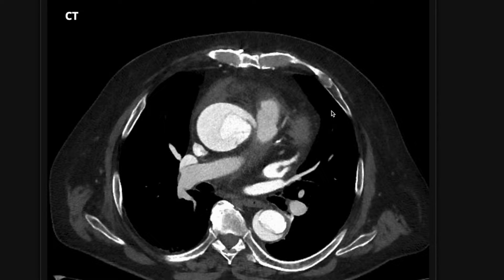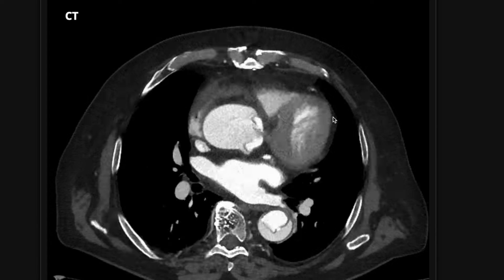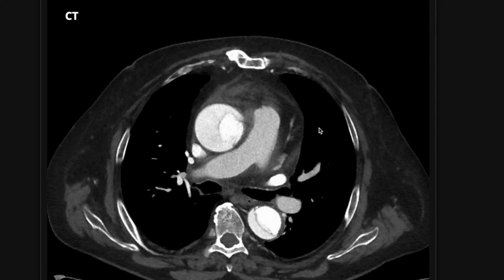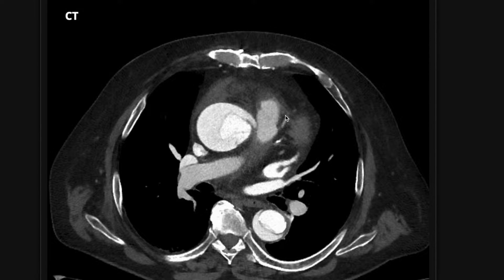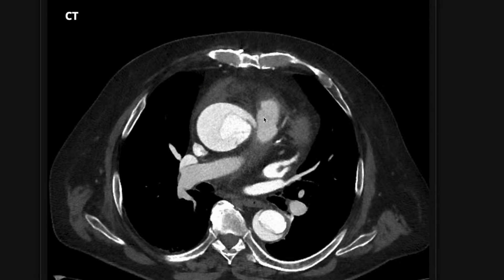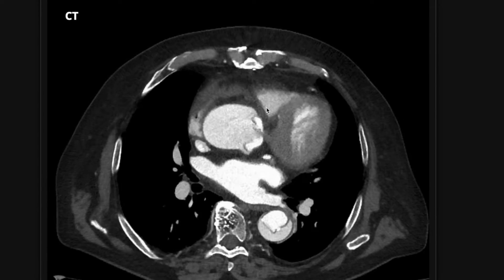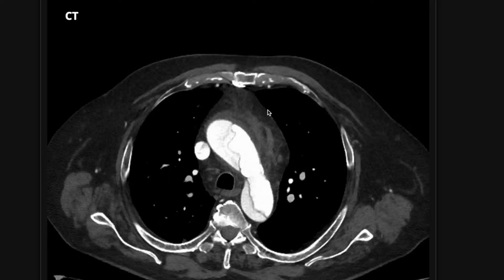Another thing to think about is whether there has been rupture into the mediastinum — is there mediastinal hemorrhage? In this case, we have a little outpouching here: a contained rupture, something called a pseudoaneurysm arising from the false lumen. It's probably leaking because we also have mediastinal hemorrhage surrounding the aorta. This pseudoaneurysm or contained rupture is probably leaking. If this gets bad enough, it can cause cardiac tamponade, which is important to let the surgeon know about.